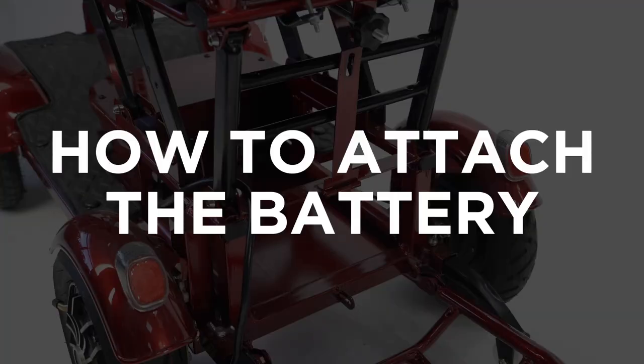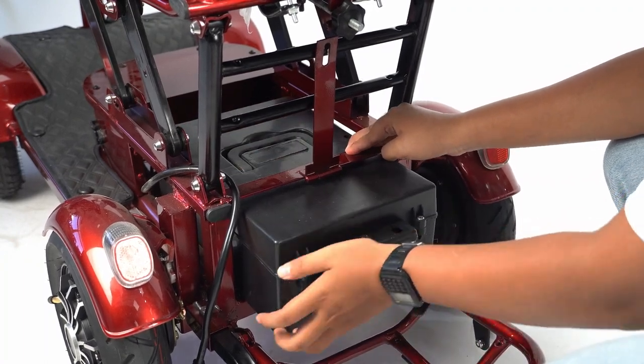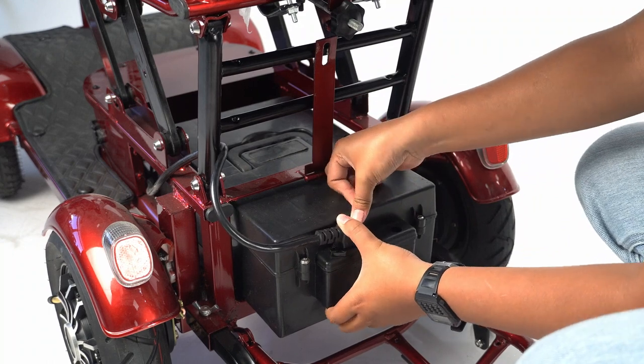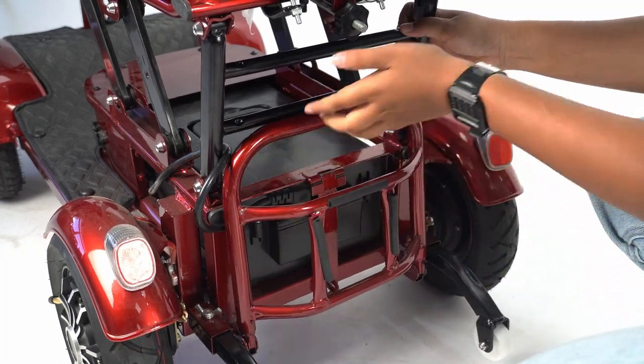How to attach the battery: Put the battery back in and plug the plug in. Push the battery in, close the metal latch, and lift the metal bar to close it.